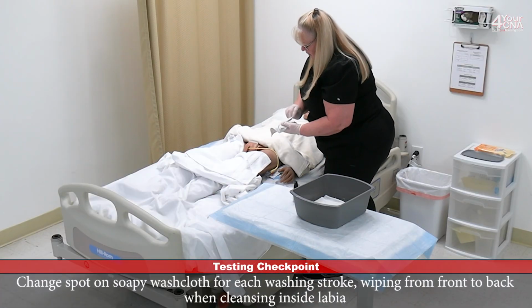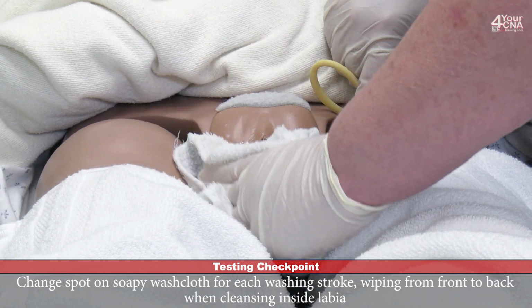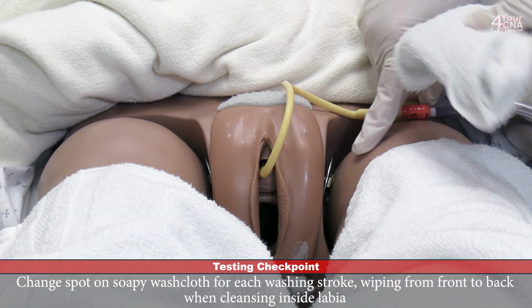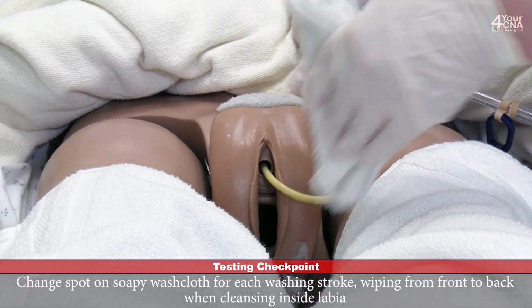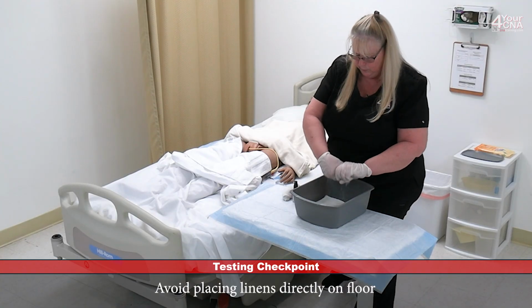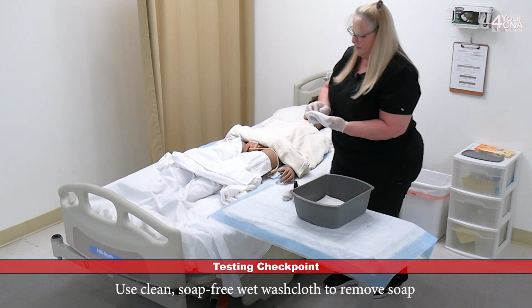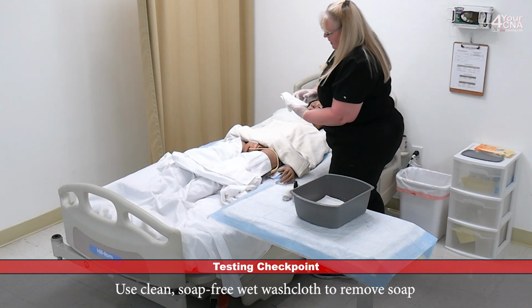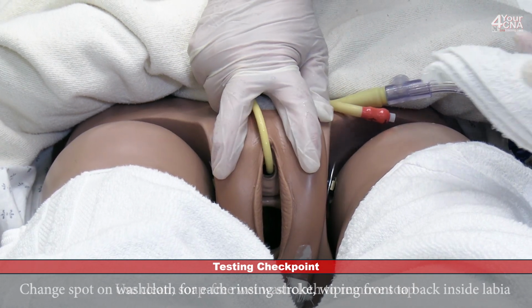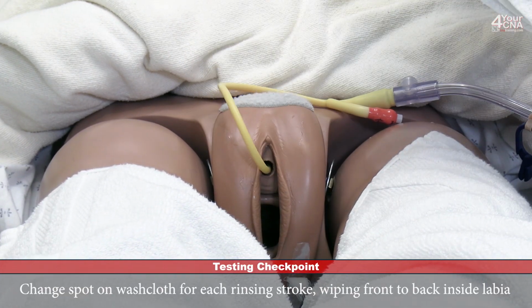We'll fold that over. The fourth leaf will wash the skin fold between the leg and the groin, top to bottom. We'll fold that over. The last leaf will wash the skin fold on this side, top to bottom. Now we'll set that aside on the barrier. And whatever we wash, we rinse. So we're going to wring that washcloth out really well. Hold it using the leaves method. I'll hold the catheter out of the way and open the labia and rinse down the center one direction, top to bottom. We'll fold that over.